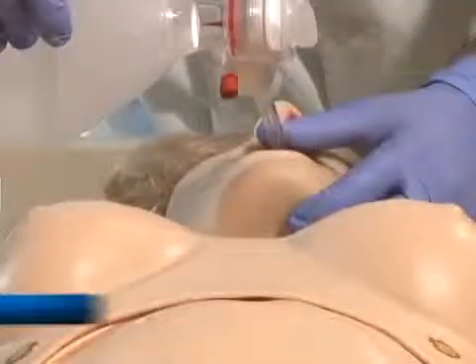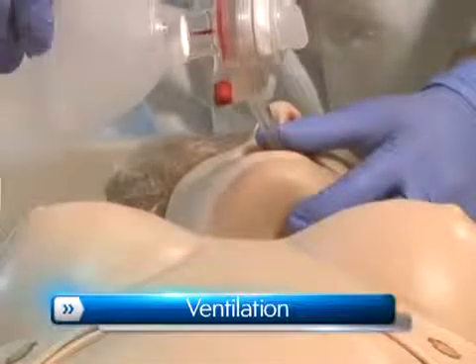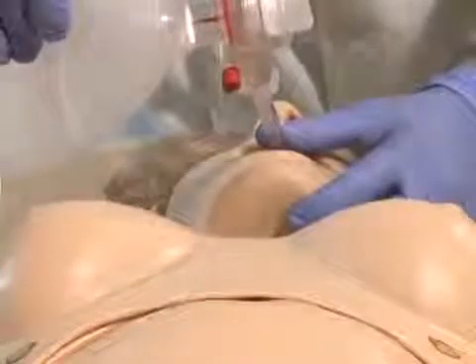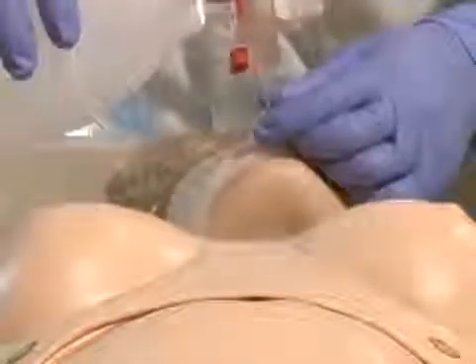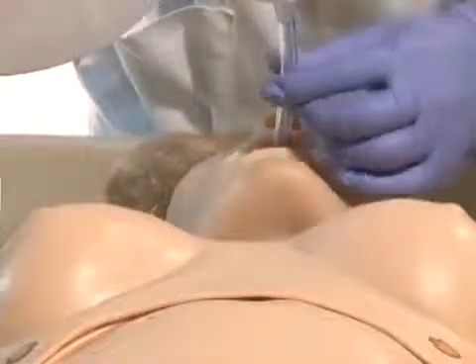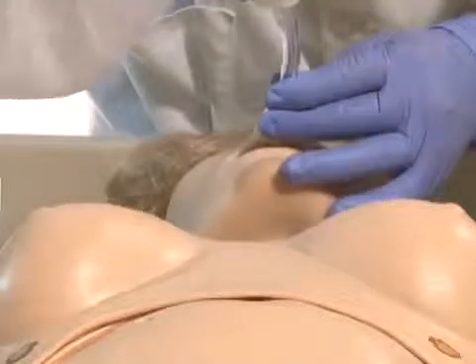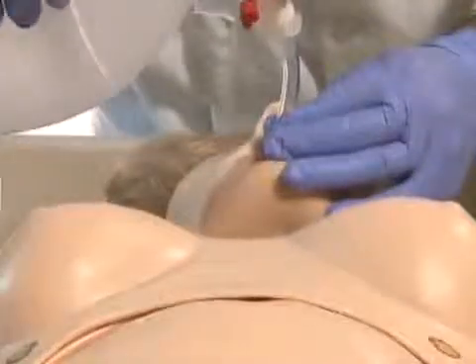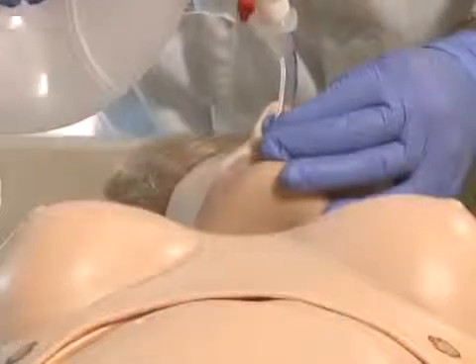Additionally, Suzy can be ventilated with a BVM or a mechanical ventilator. Once intubated, sensors detect the depth of the intubating tube. Should the tube be inserted too deep, the left lung is automatically disabled, realistically demonstrating right main stem intubation.